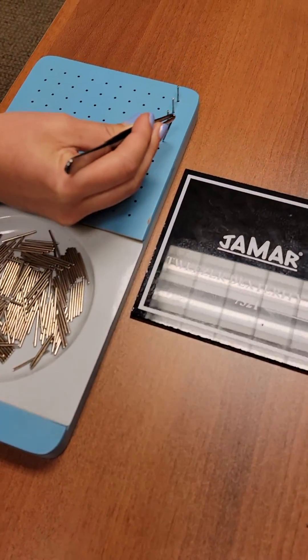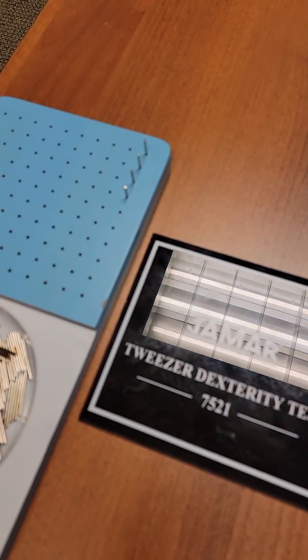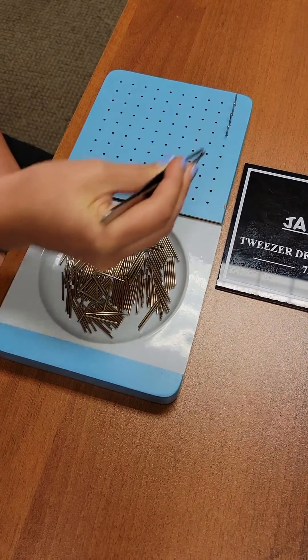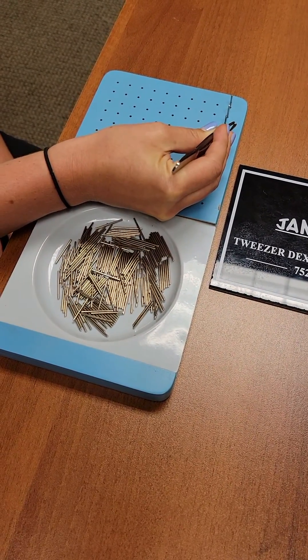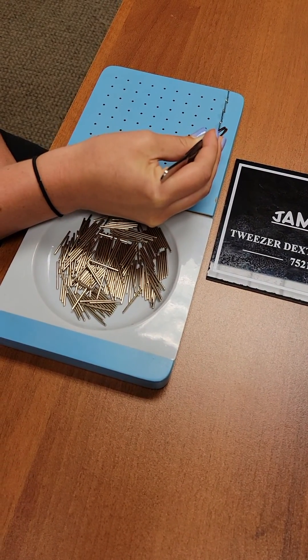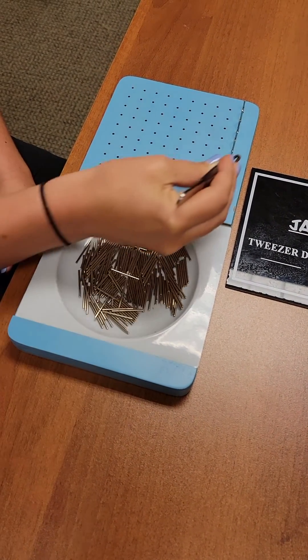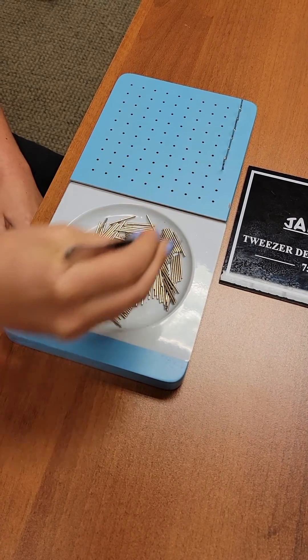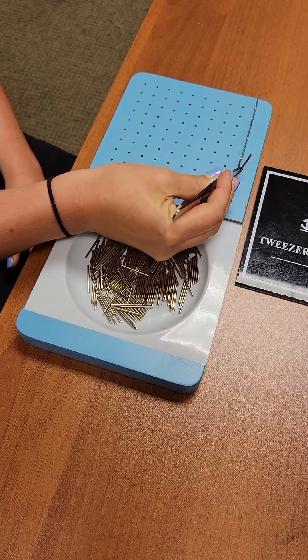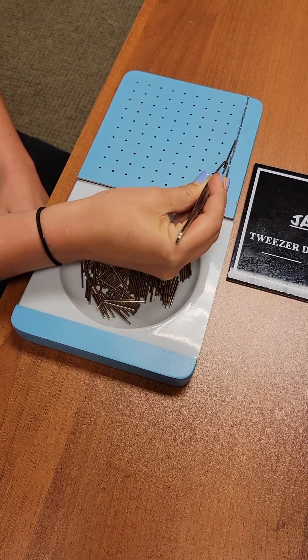Trust me, it's harder than it looks. I dropped several before we decided to put Andrea in charge of putting the pins in. As you can see, it could take some time especially if somebody has a hand injury. The norms are based on the type of worker that we're treating, but this is basically what it looks like.